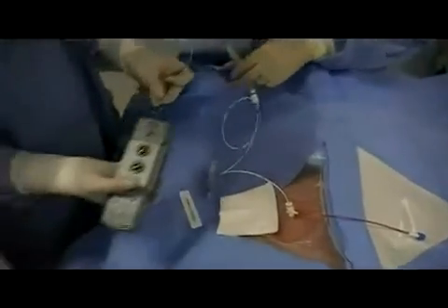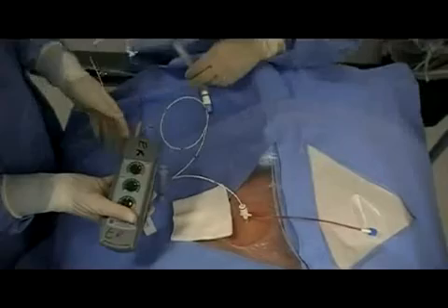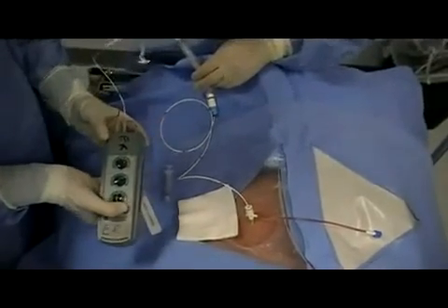Ports should be inserted positive to positive and negative to negative. At this time, the pacing box can be turned on.